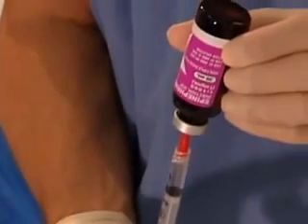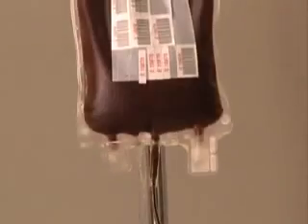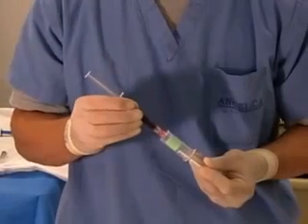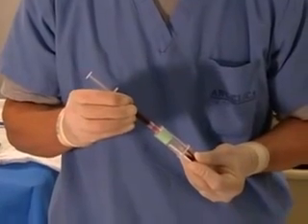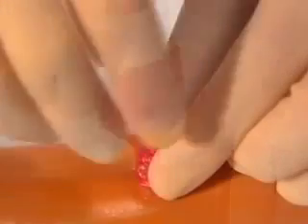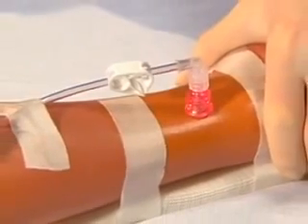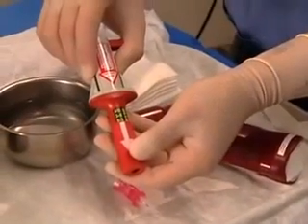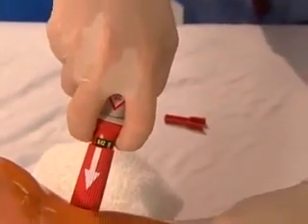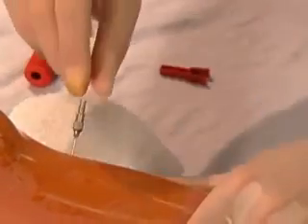Intraosseous access provides a rapid and reliable means for delivery of medications, crystalloid fluids, blood, and colloid products during pediatric resuscitation. In addition, when intraosseous access is achieved, blood samples can be obtained for laboratory analysis. Numerous studies show that an intraosseous catheter can be placed more rapidly than a central venous catheter, and that this technique is more reliable than venous cut-down. With the introduction and availability of power-assisted devices, which greatly facilitate intraosseous placement, guidelines now support the use of intraosseous access in patients of all ages.